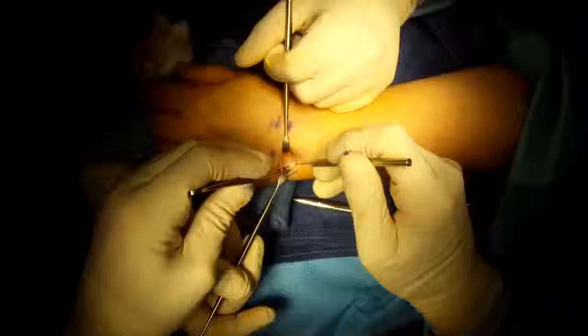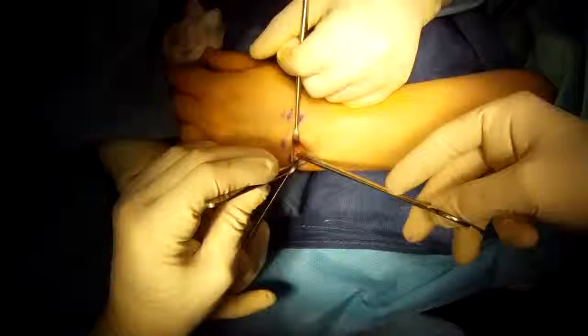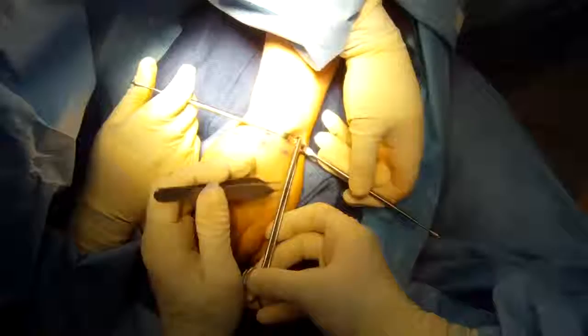The problem is that the tendon is stuck in this tunnel — it needs more space. I'm going to use a scissor to release into the hand, make sure there's plenty of room, and the scissor can easily get in there now.